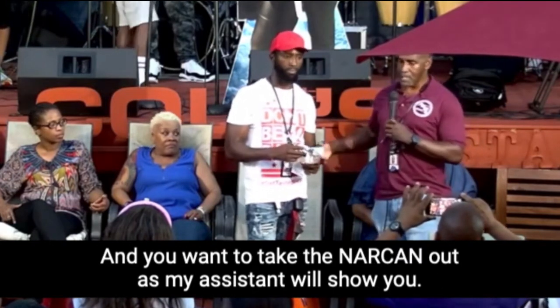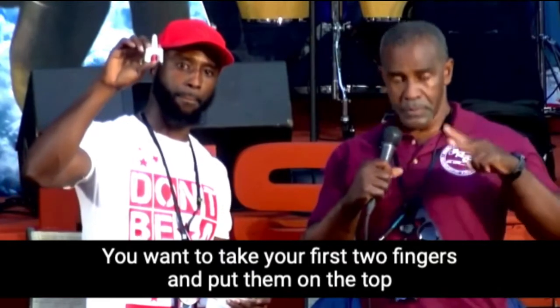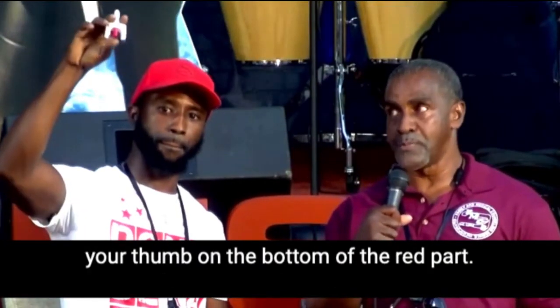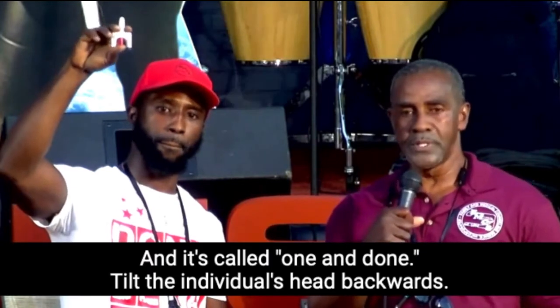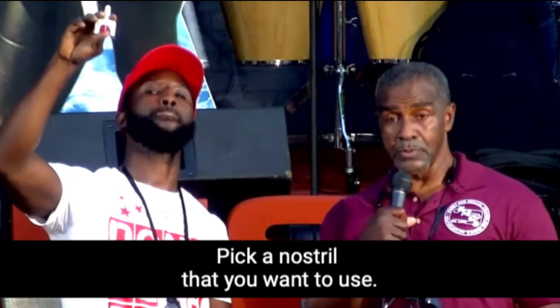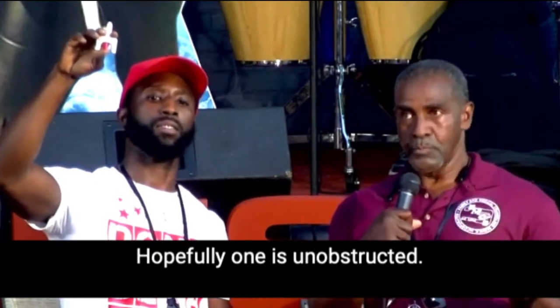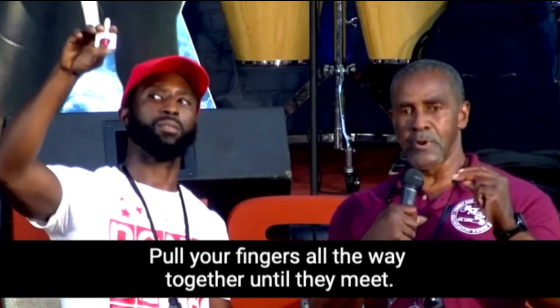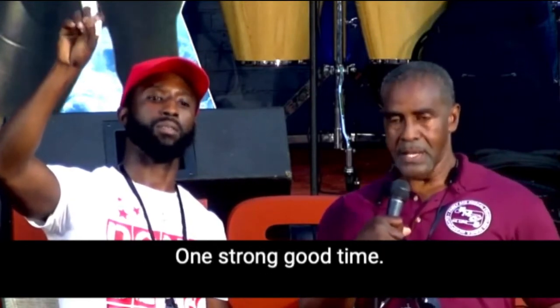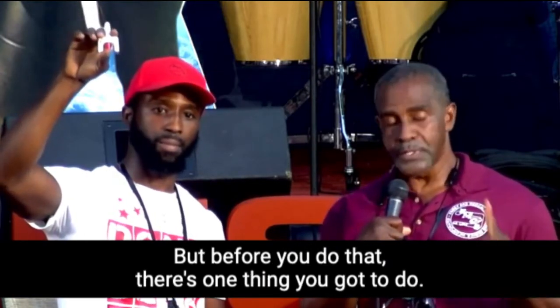Then you want to take the Narcan out, as my assistant will show you. You want to take your first two fingers on the top and your thumb on the bottom of the red part, and it's called one and done. You tilt the individual's head backwards, pick a nostril that you want to use, hopefully one that is unobstructed. Pull your fingers all the way together till they meet. One strong, good push. But before you do that, there's one thing you've got to do.